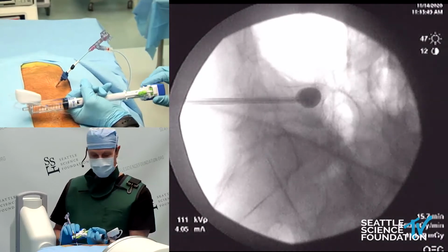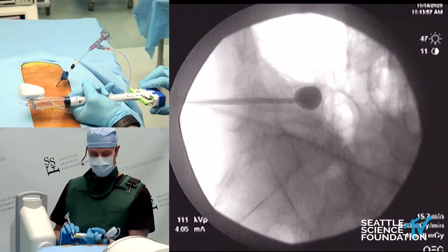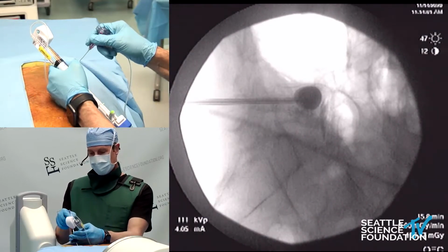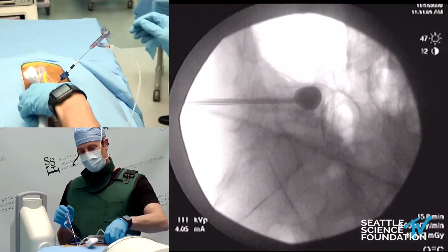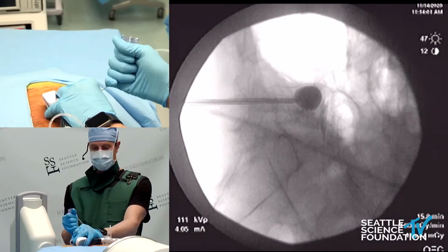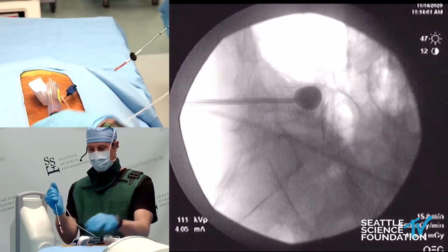And it's inflating exactly where it should. All right, 6 cc's, 7 cc's, and I'll trigger, and I'll pull this out. I'm going to trigger and lock it and keep the pressure on, because this will need to be consistent, steady pressure, because this is a big balloon. And we'll turn the proximal portion counterclockwise, and we're there.